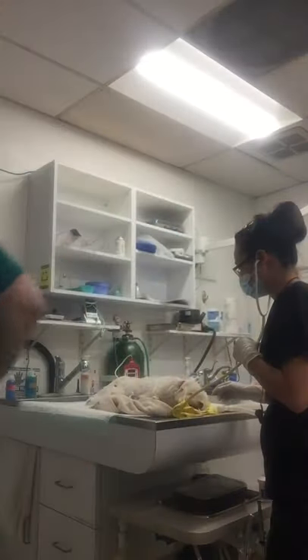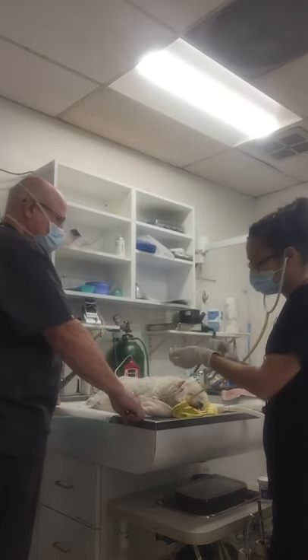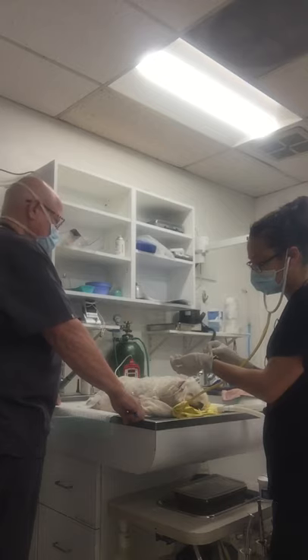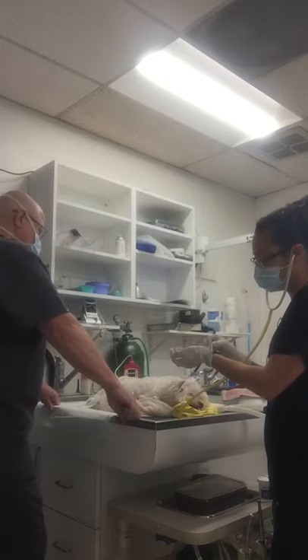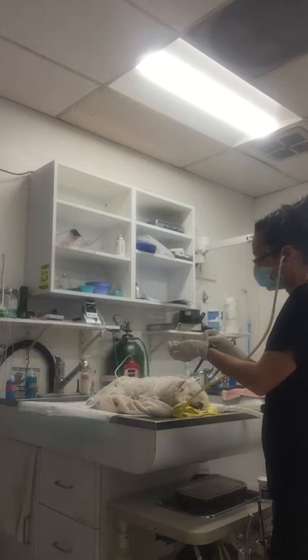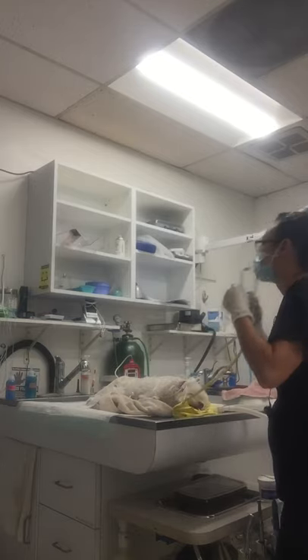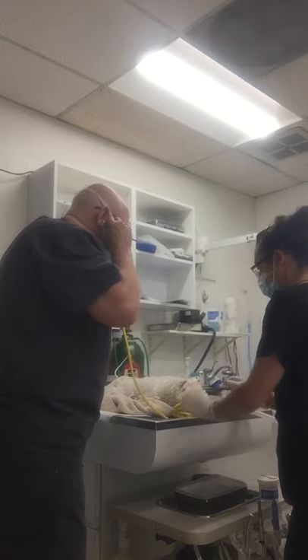We'll take a listen. I can hear the heart rate and I can hear the pet's respirations — about 150 to 160 beats per minute, and about 20 to 25 respirations. To verify placement, I'm going to hand this over to the doctor so he can verify that there is a heart rate and respirations.